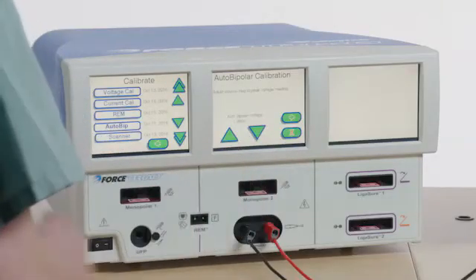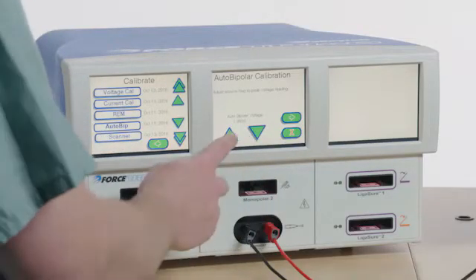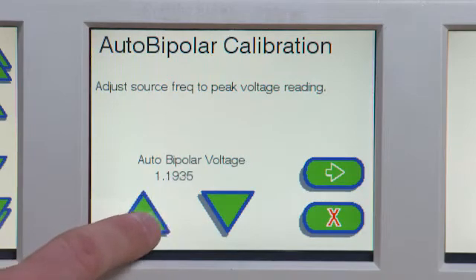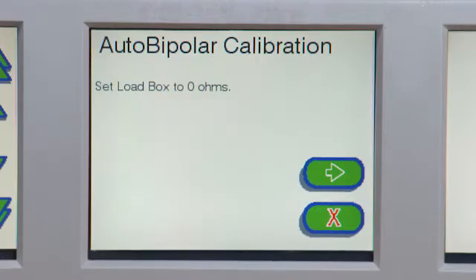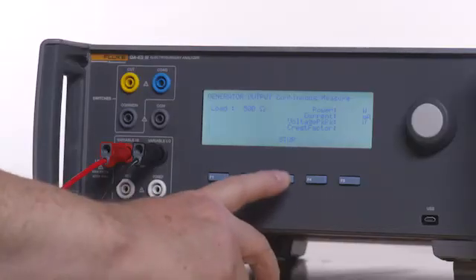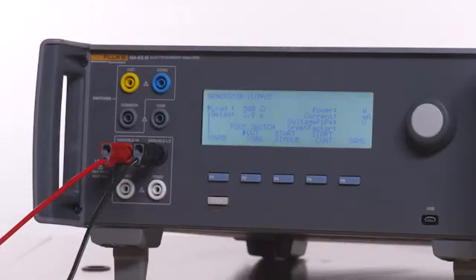Follow the on-screen instructions on the Force Triad to set peak voltage as displayed on the QAES-3. Press Next on the Force Triad when completed. Press F3 on the QAES-3 to stop the test.